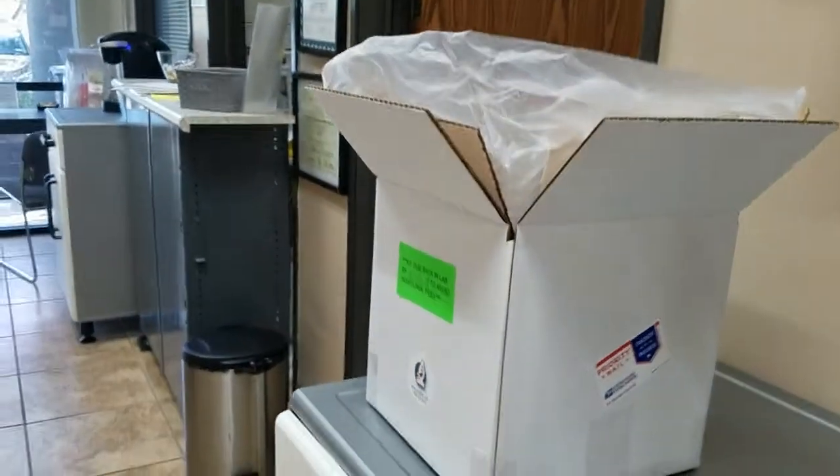Hi, my name is Jean from the Mold Lab. Today I'll be showing you how to take mold samples using our airborne mold test kit.